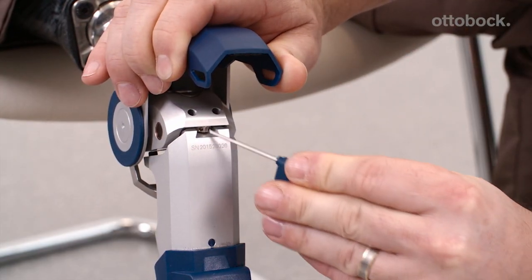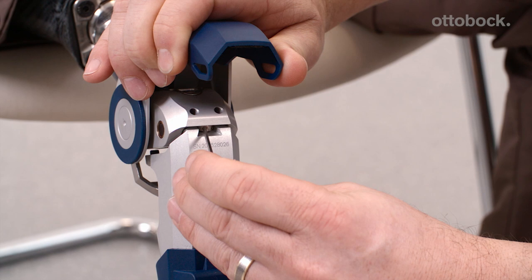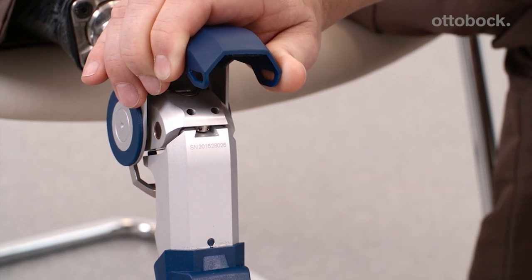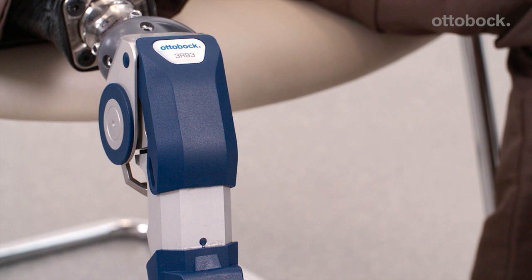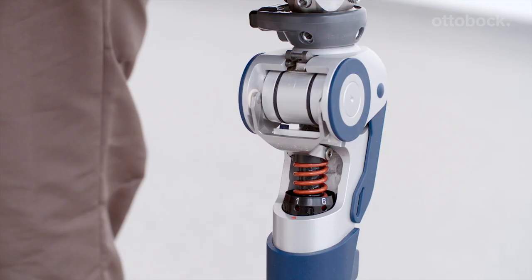You can make this adjustment by using the adjustment wrench to turn the tension compensation screw slightly in either the clockwise or counterclockwise direction. You can tell that you have reached the right setting if there is no noticeable brake play when the prosthesis is loaded and the pendulum movement of the prosthetic lower leg is not impeded during the swing phase. The swing phase of the 3R93 is controlled mechanically.